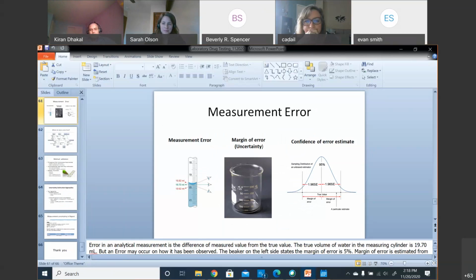Error in terms of if your quantitation is, for example, 100 nanogram, it can be within certain limits. If it is within 95%, then their error margin is 20%. So you are 95% confident that your analysis, no matter where you take it, will be anywhere between 80 to 120 with 20% error.